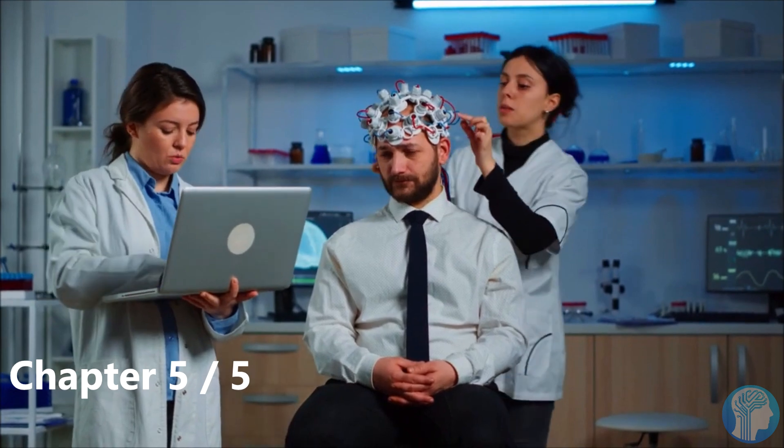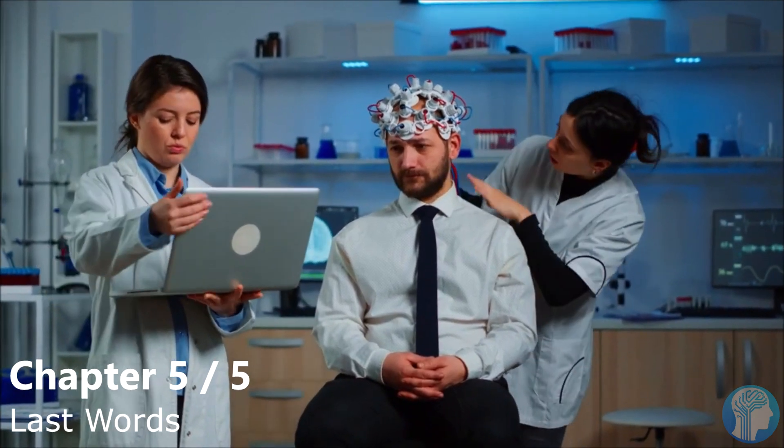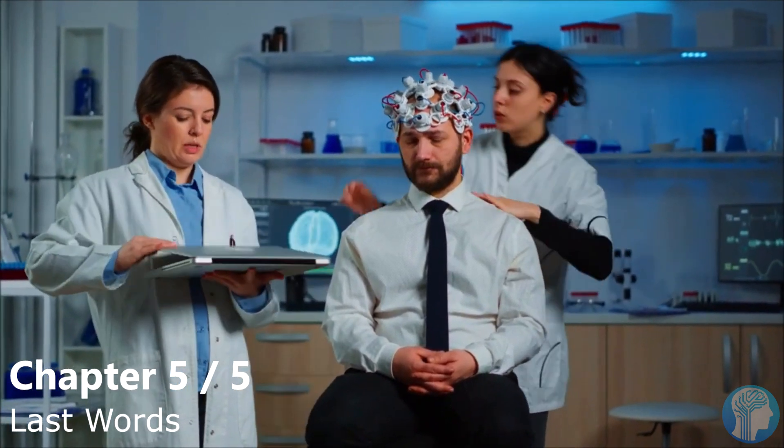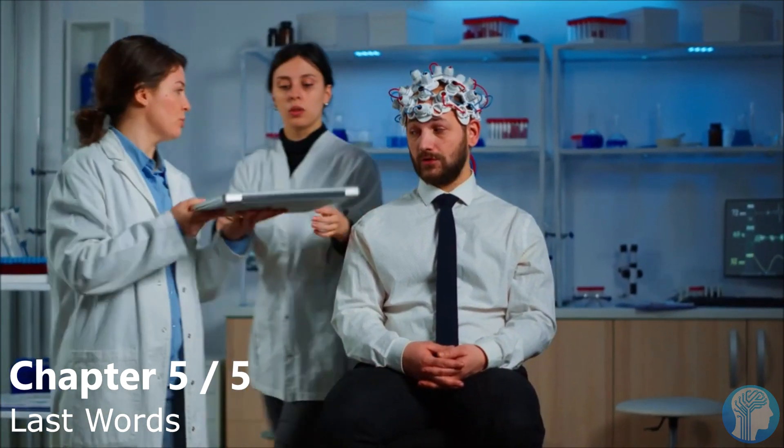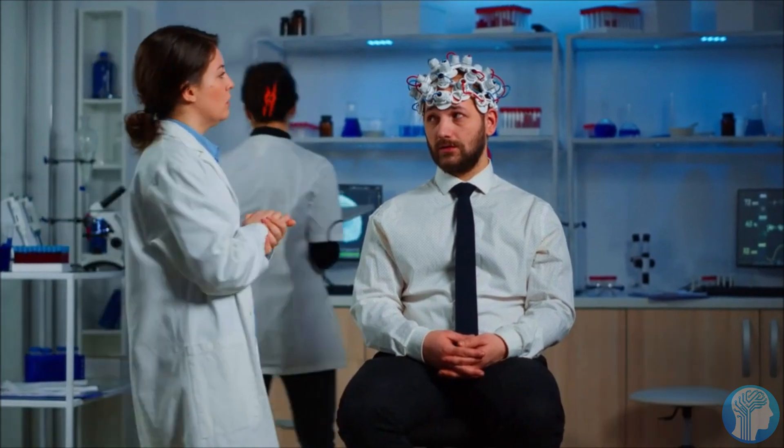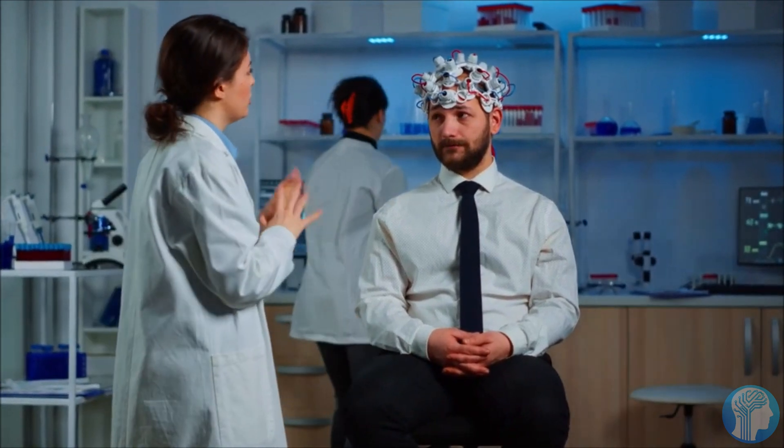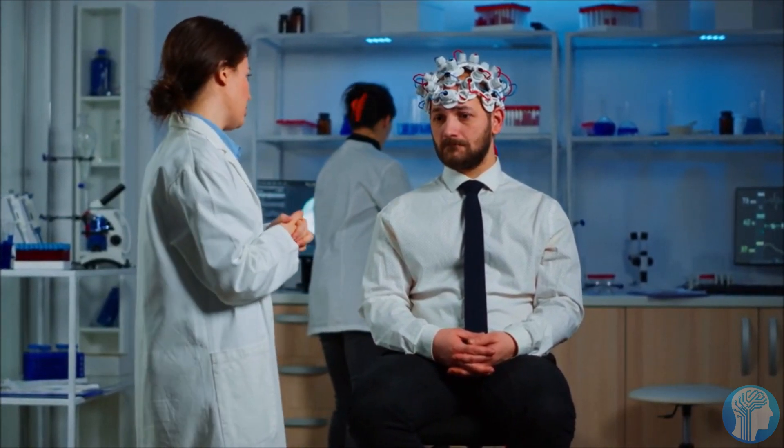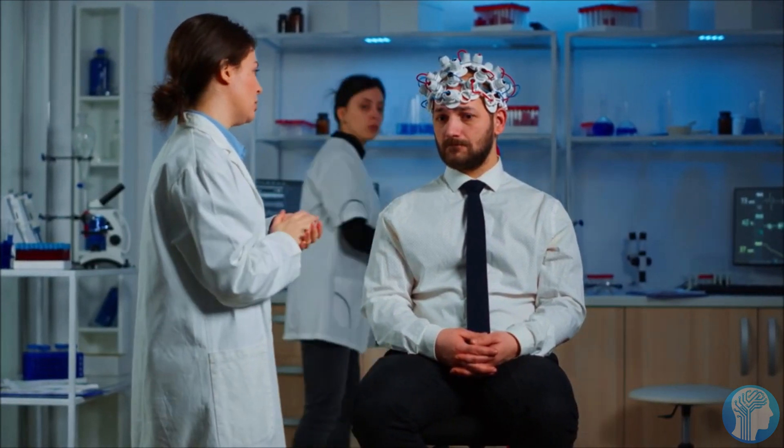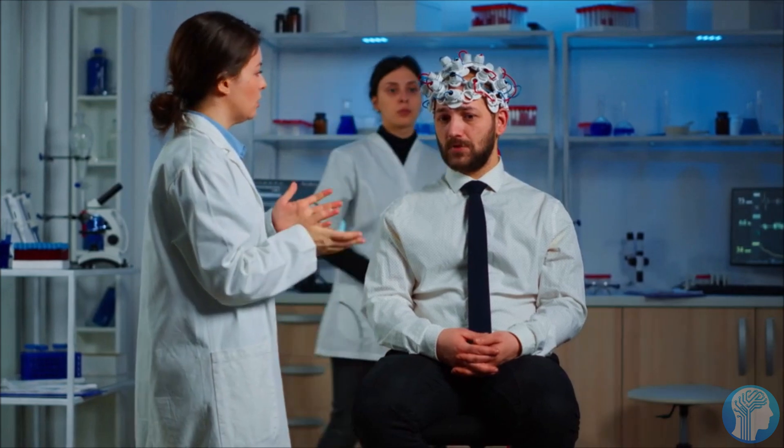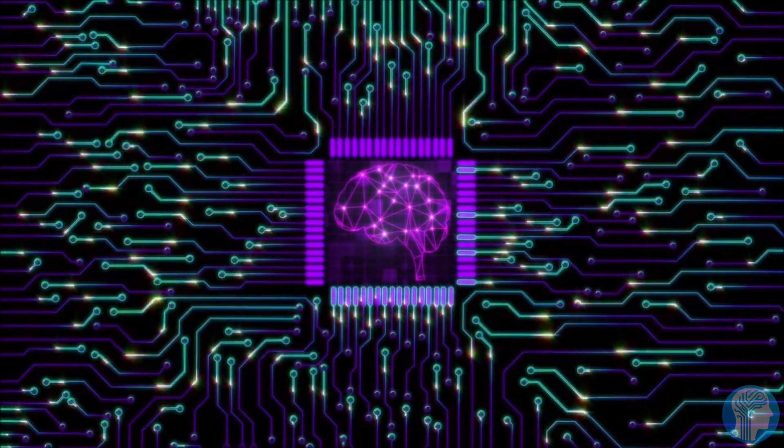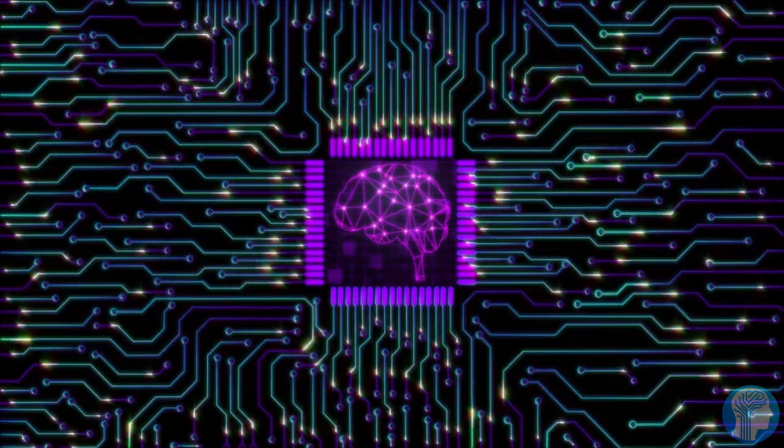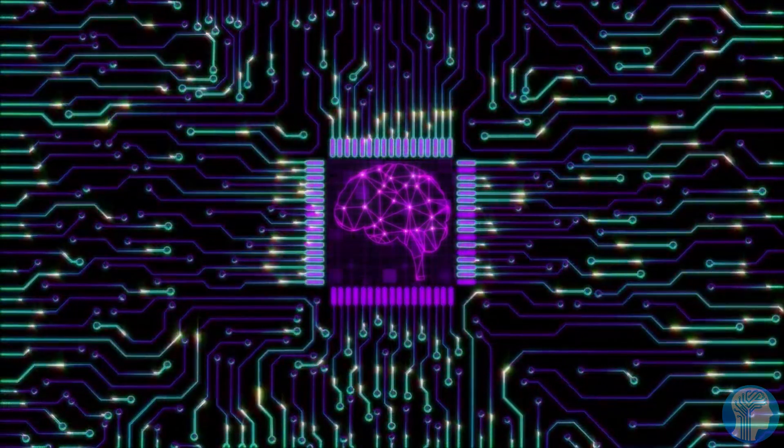Tripathi's firm is nearing completion of its first prototype, which will include mechanical phalanges, for a growing list of potential customers. At Cybathlon 2024, Tripathi intends to demonstrate off its own robotic hand.